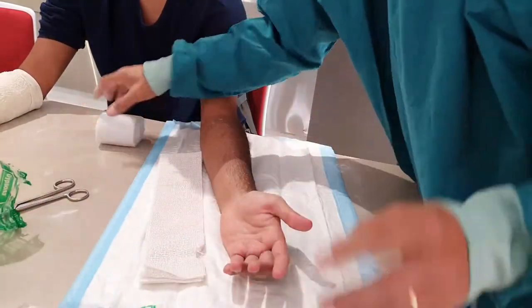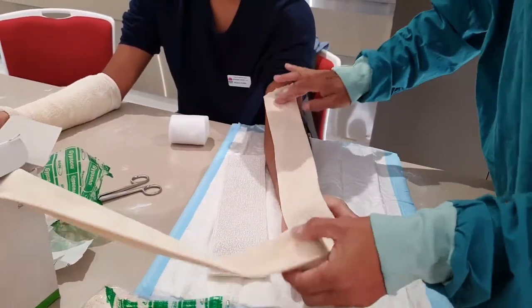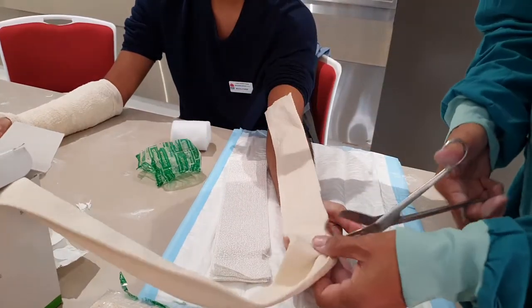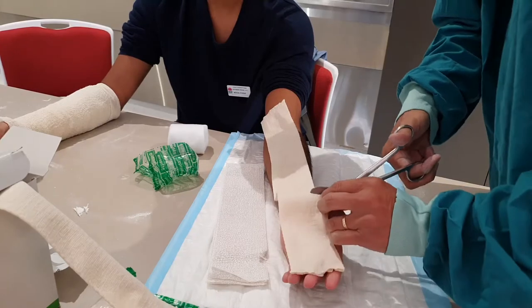Underneath the plaster, I'm going to measure the stockinette — roughly halfway to where the bicep is — and then I'll just cut here.